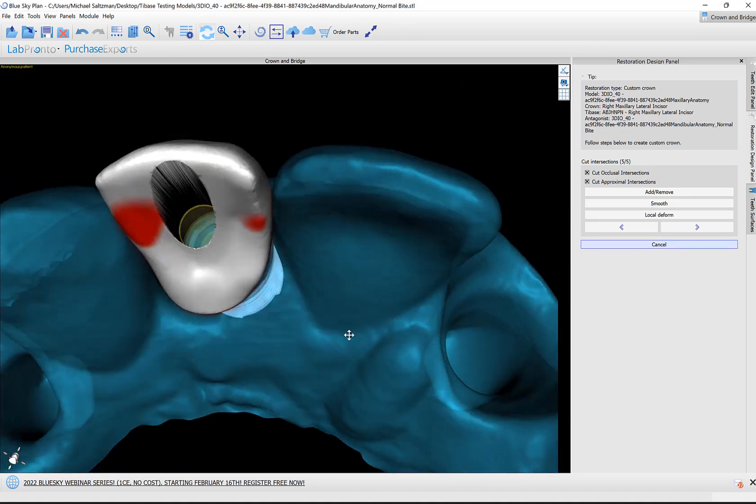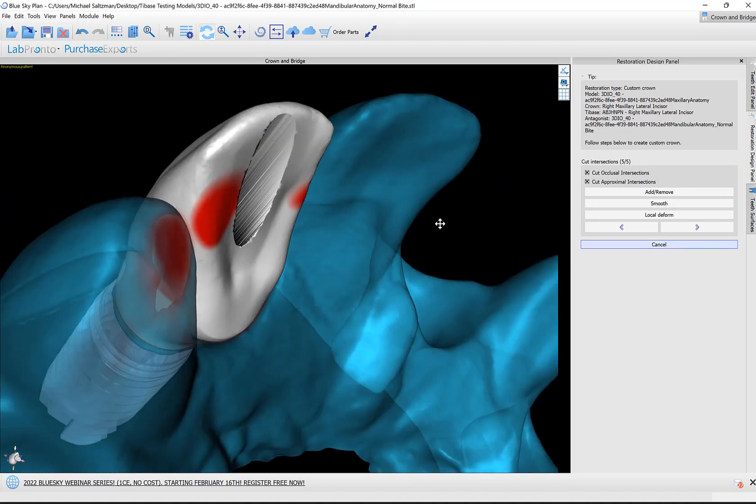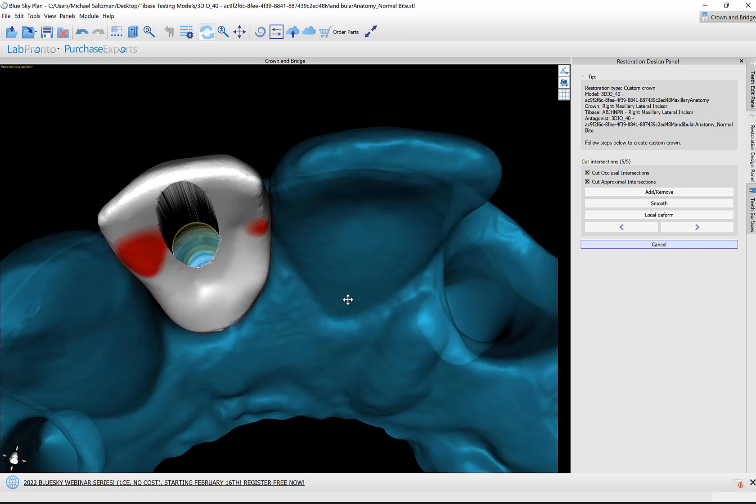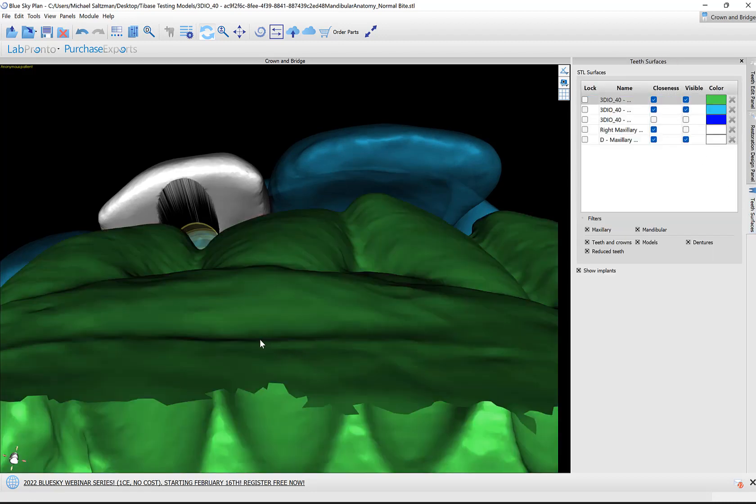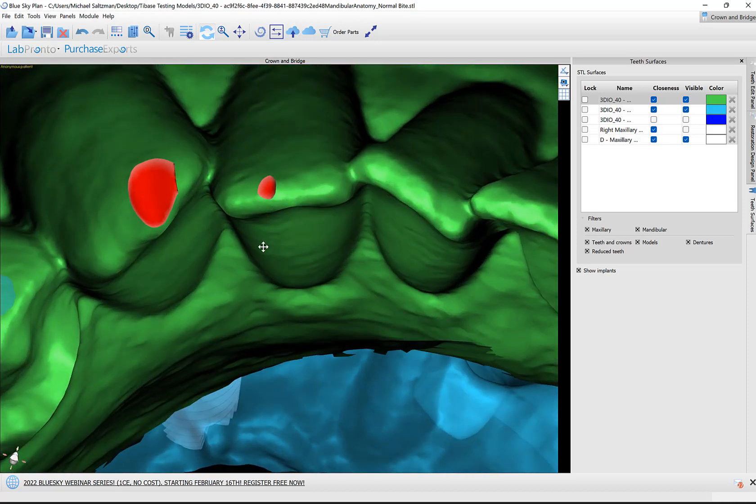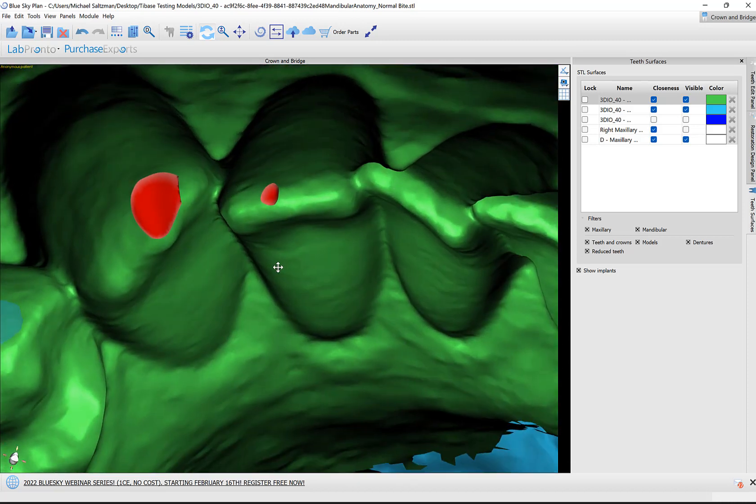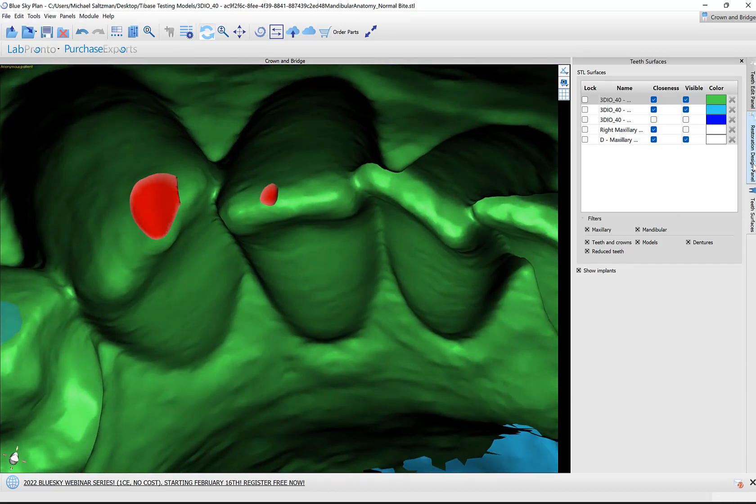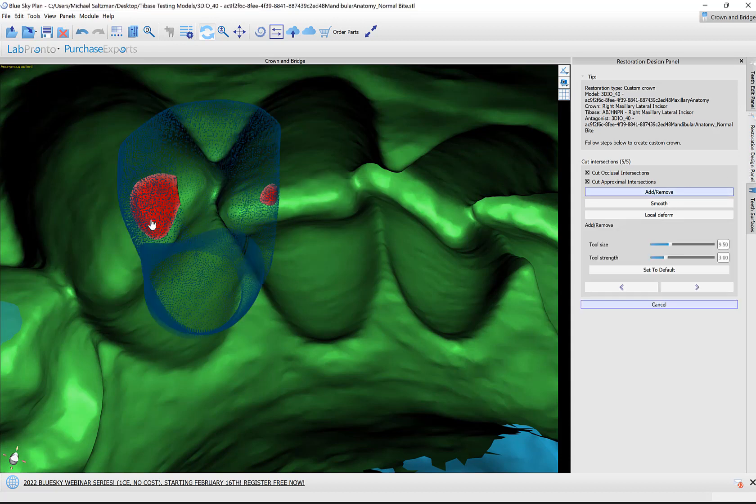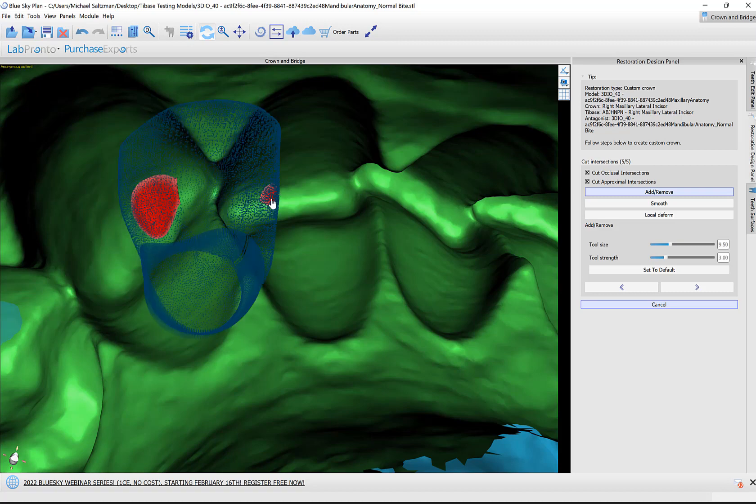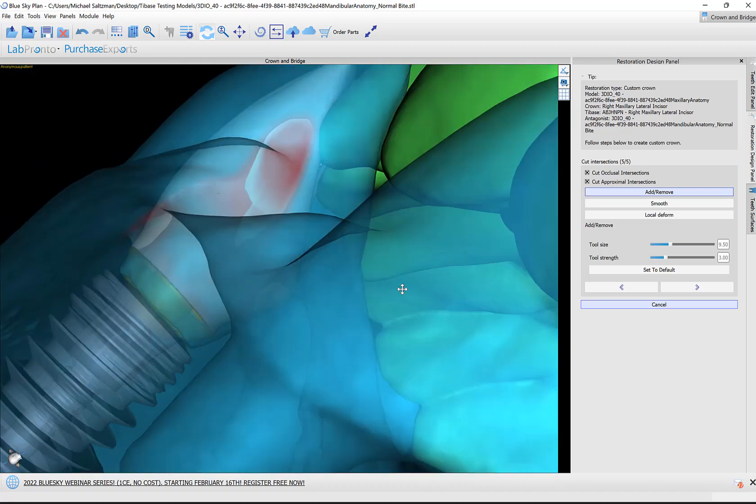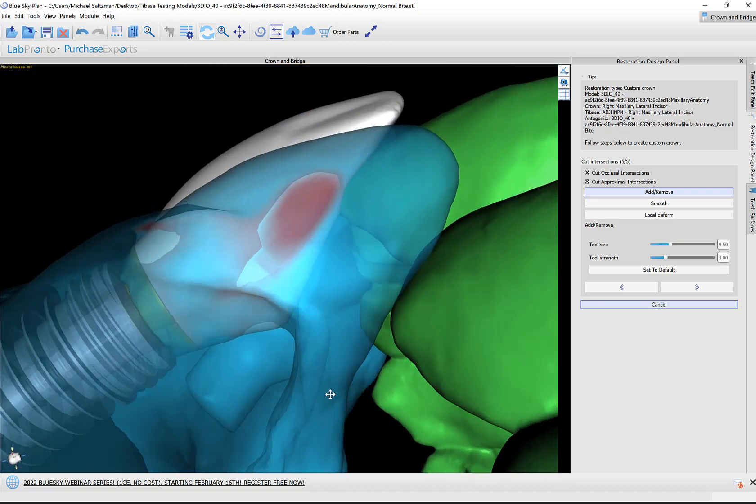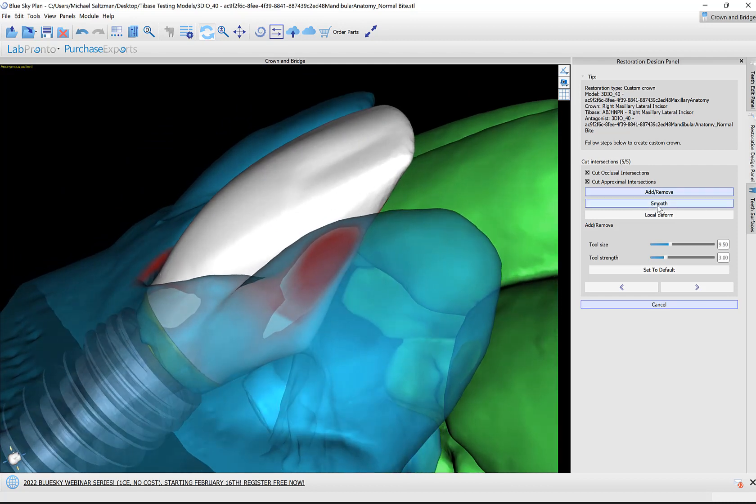We're at the last step of the process. The software is showing us in red our intersections. We could toggle on the opposing arch as well. We could see here how it's protruding slightly or intersecting slightly. We could use our design tools at this point if we would like to add or remove material. I'm holding down the control key and my left mouse button to remove some material. We could do this from any side, any direction. We could use our smooth and local deform as well.